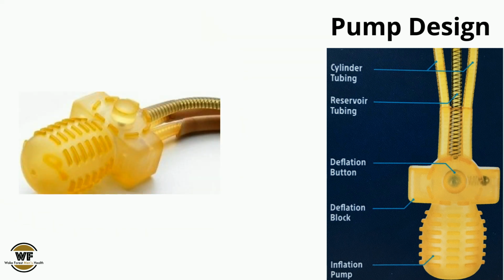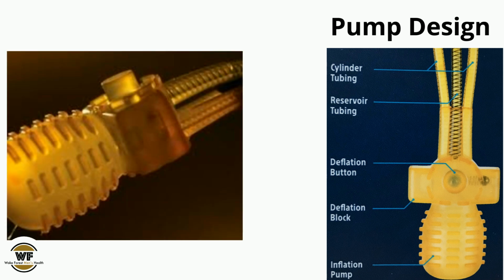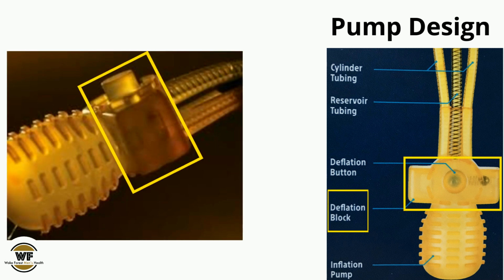If we rotate the pump, you can get a sense for the height of the deflation button. If we rotate further, you'll see that the rectangular block around this button is flat on the back side. This is useful for orientation and elevating it to your finger or thumb when pressing the button. You want to avoid pressing this button by mistake when filling the implant.